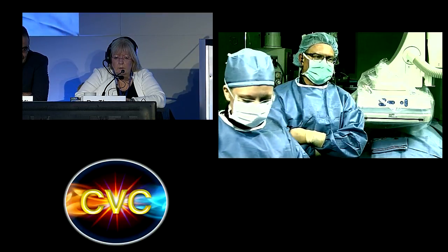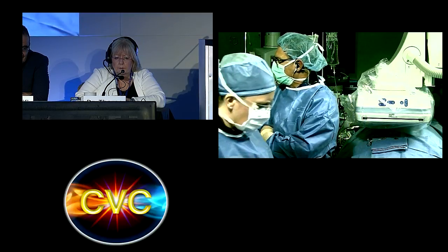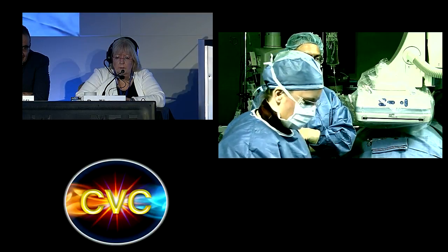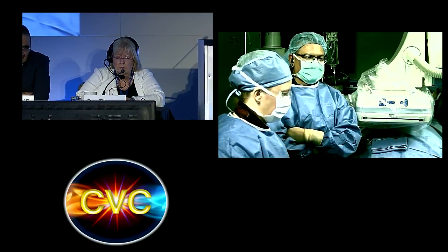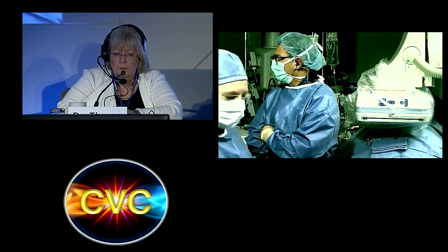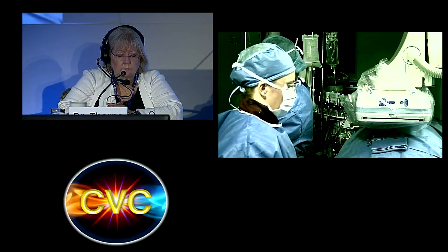Okay, let's see. We have a 14 by 80 right here of one of the wall stent. Yeah, you're right, Nitinol. We can have that also. I used the EV3 before with 14. We have it here available as well. What did you find? All right, bring it in.